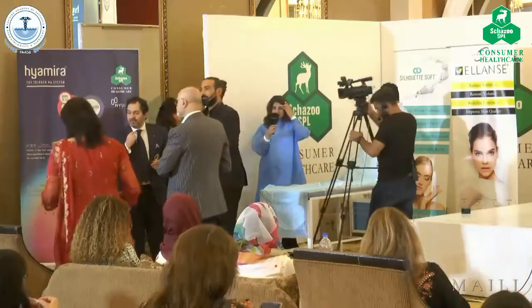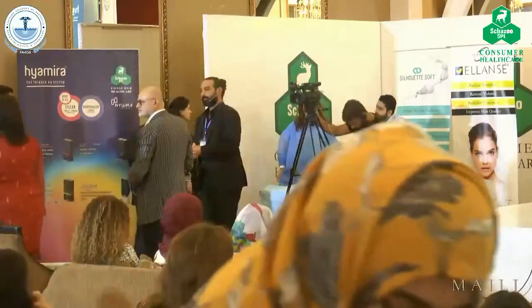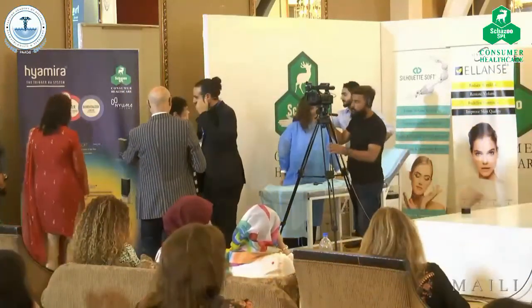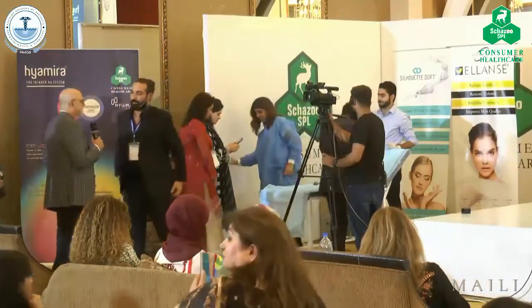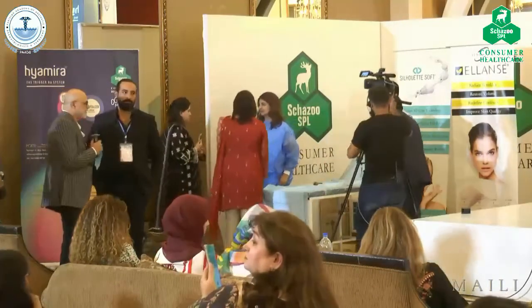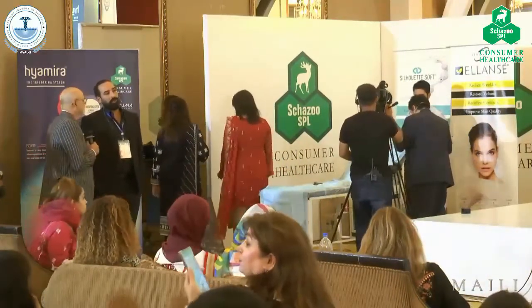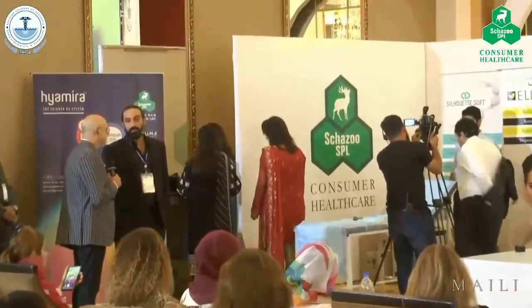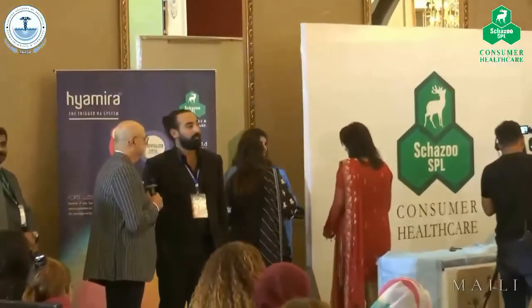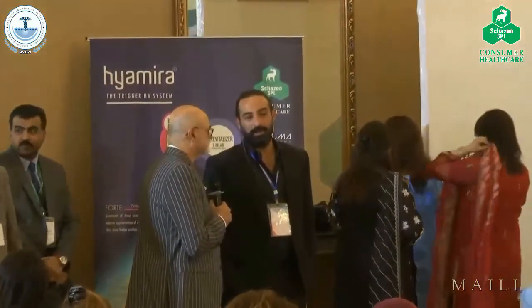Okay? Second pair of lips, second patient. So, Dr. Rami, what's your opinion about injecting the lip with a cannula? It's more painful. I don't have much experience in it. I find that using a needle is more precise, especially in areas where every little bit matters.